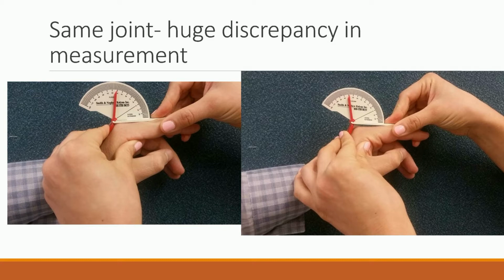Also, you have to obviously clean the goniometer after each time, or discard it depending on what you're using. You can't really apply it if the patient has a bulky dressing. Patients that don't want to cooperate too much or don't have the patience to undergo the whole examination will get bored and probably upset by this whole exam.